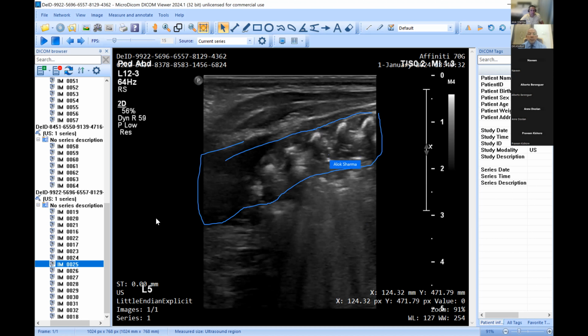Were these bronchograms static? It was static bronchograms, actually. Yeah. And you can see these areas of linear air bronchograms. So that for me looks like lung atelectasis. You've got consolidation here with a lot of static air bronchograms would be my impression unless you say otherwise. So was this baby nursed supine and then turned prone? Yeah, I think so, actually, because they had just done the cares and moved him to a different position. So the difficulty is in a baby who was stable. Otherwise, when you see this, I don't know what to do with it.